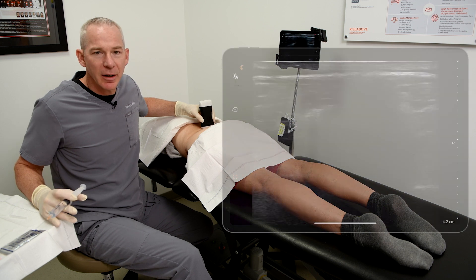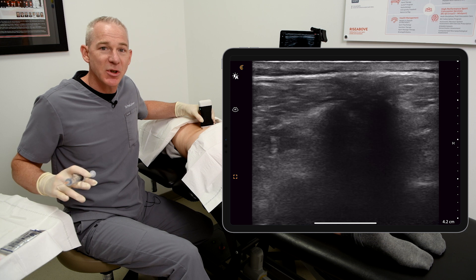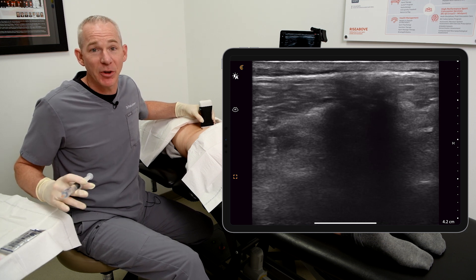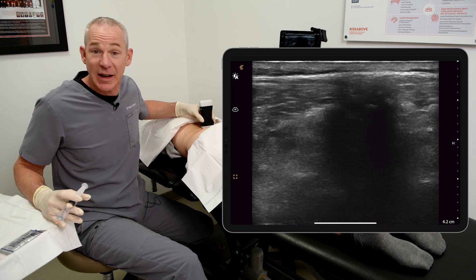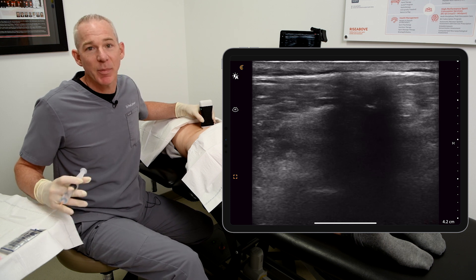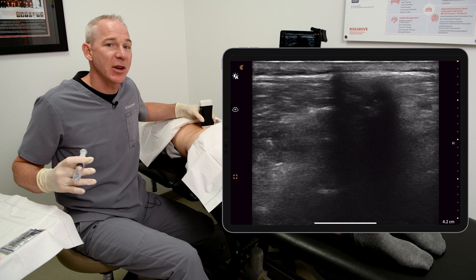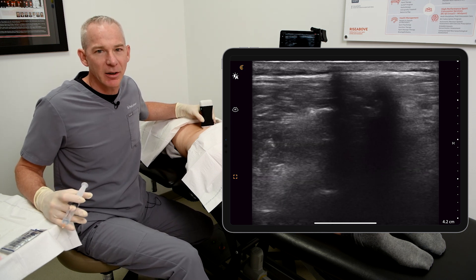The linear Clarice L15 can do a great job of many things. However, sometimes a curved probe is nice to have. We don't have that today, so I will demonstrate how to do lumbar spine using the linear probe, in case that's all you have in your clinic. It's nice to have a patient who weighs less than 150 pounds. I strongly advise if you have a patient that weighs more than 150 pounds to look into buying a Clarice curved probe.